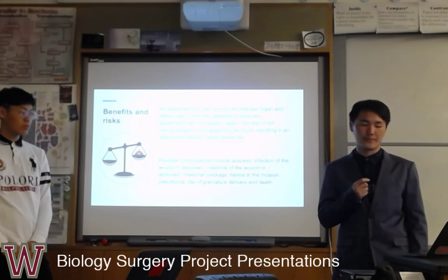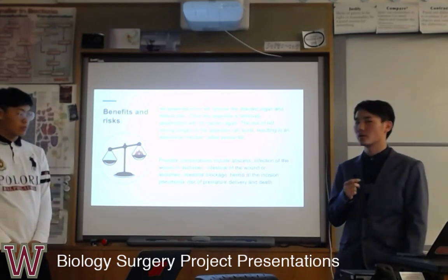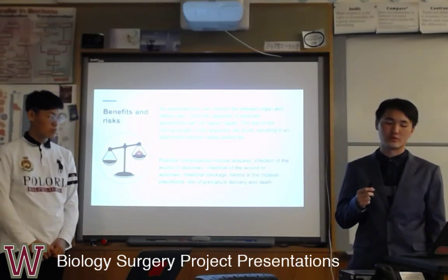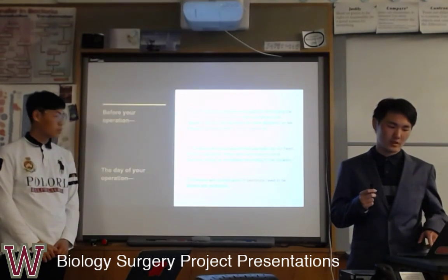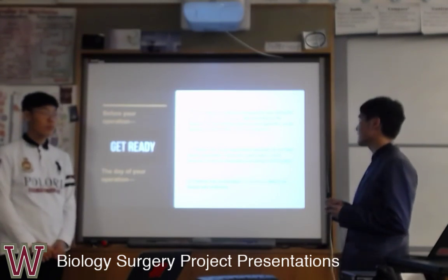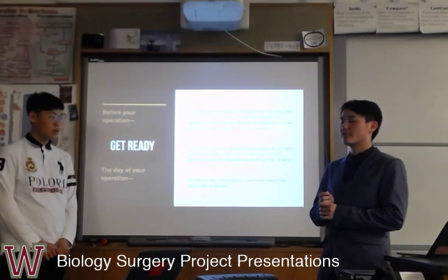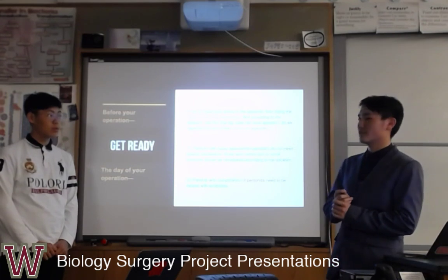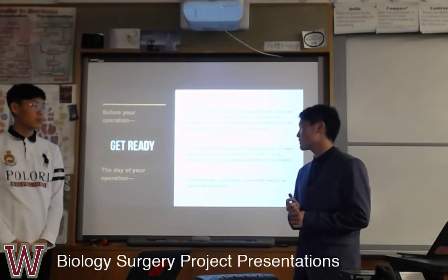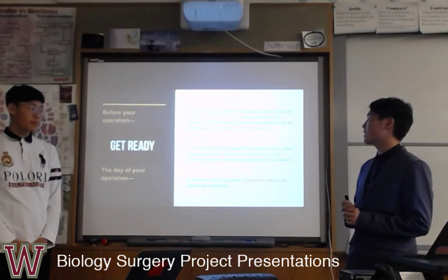Most of the time, the surgery will be successful because it is easy for the doctor and for us to do. Before your operation, we need to use an X-ray to make sure where it is. But according to the research, we found that the pig does not have an appendix. So we regard the end of the cecum as the appendix. Also, on the day of the operation, patients with acute appendicitis generally do not need special preparation.